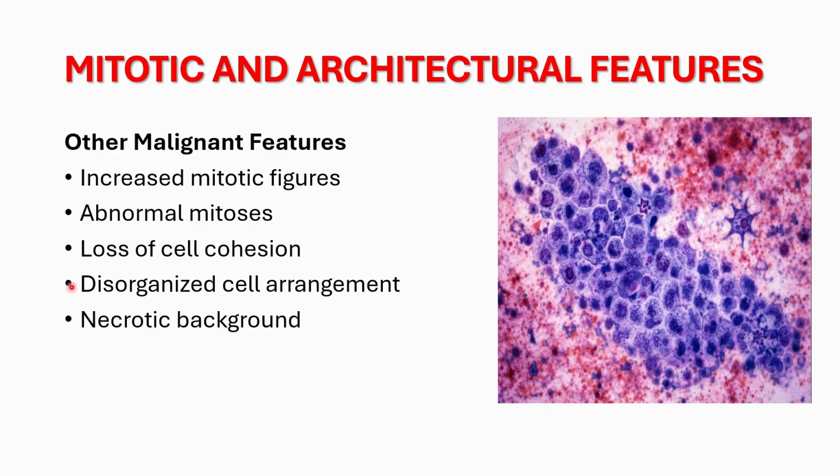And there will be a disorganized cellular arrangement, and we can see a lot of necrotic material in the background, because with the rapid growth, that much blood supply won't be there in malignant tumors. Because of that, we can see a lot of necrotic background material.